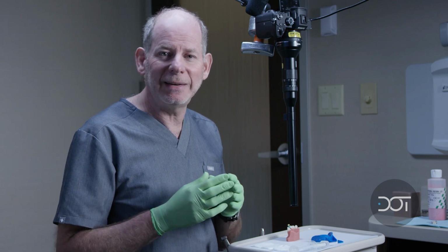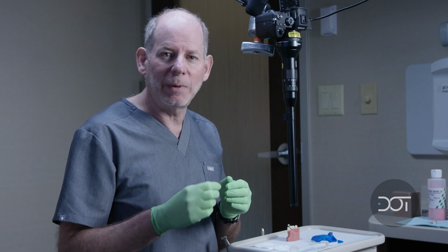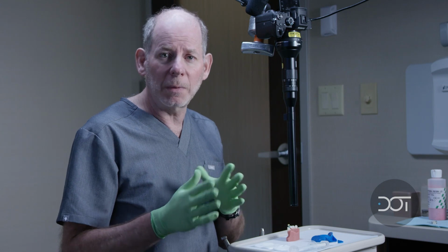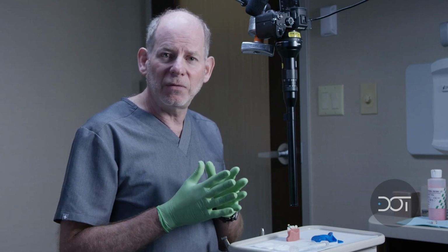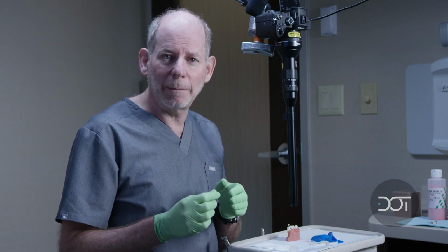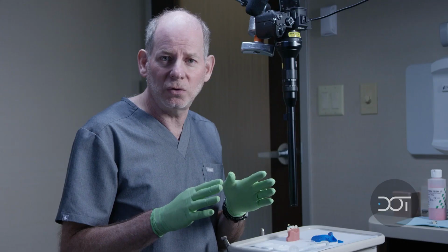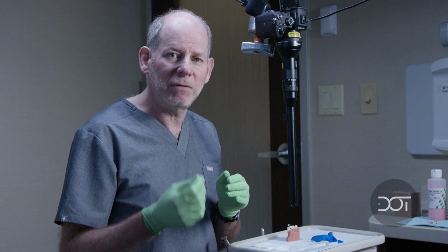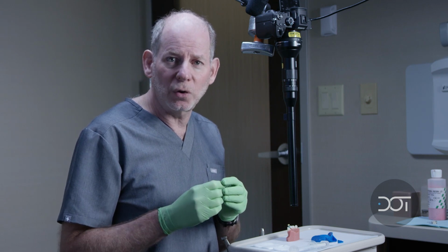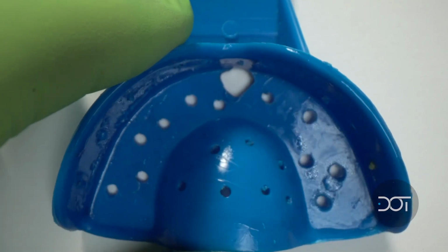Now in practice, I'd have my dental assistant filling the tray while I'd be working in the mouth. Now I might have a second assistant to help me in the mouth, but many times I'm doing this on my own. So I'm going to play both parts today. I'm going to start out by filling my impression tray with a heavy body material. I'm going to set that to the side. Then I'm going to go to the mouth and I'll show you how I use my light body material around the soft tissue and around the surfaces of the adjoining teeth, and then how I use the heavy body material in a disposable syringe to be able to get in and inject that around the impression coping itself. So let's get going. I'll show you how I do that. So you can see the adhesive is painted on my impression tray.